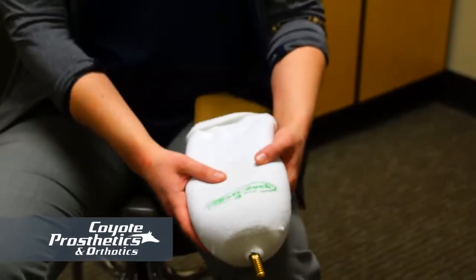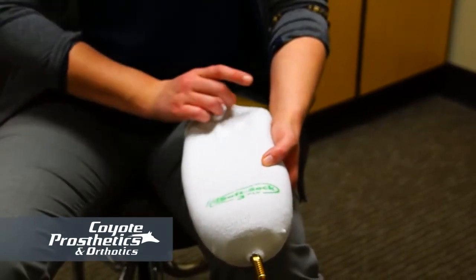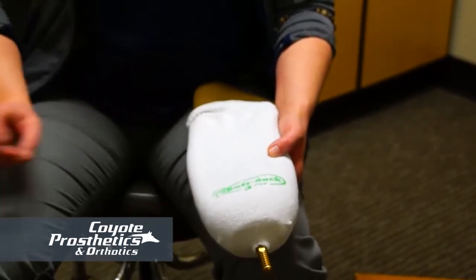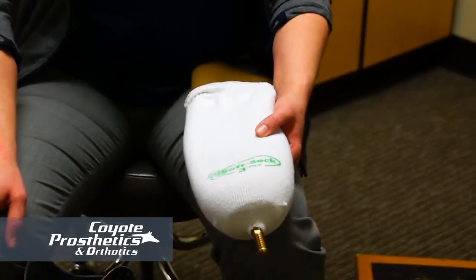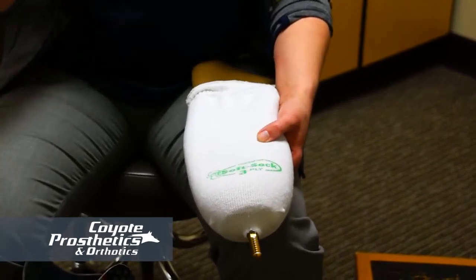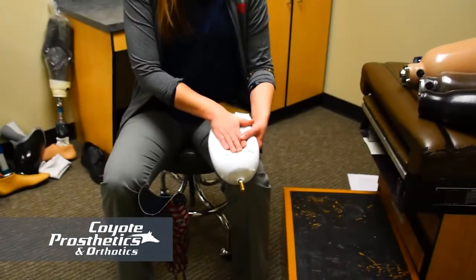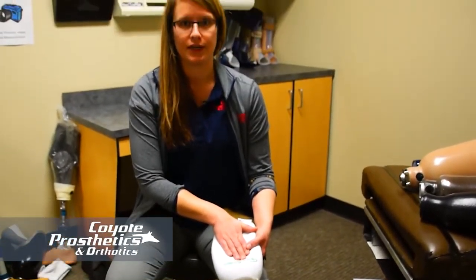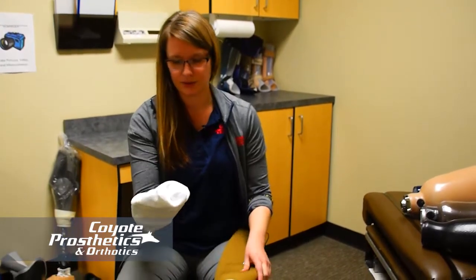And they come in different thicknesses. This is a 3-ply sock. It says right on there, some of them have different colors on the edges. Generally the ones that we use are lightweight, 3-ply, 5-ply, and sometimes 6-ply. And the higher the number, the thicker the sock. So they're pretty easy to deal with that way. You can just wash these like any sock, washer, dryer, or you can hand wash them, let them hang dry. That's kind of your choice.